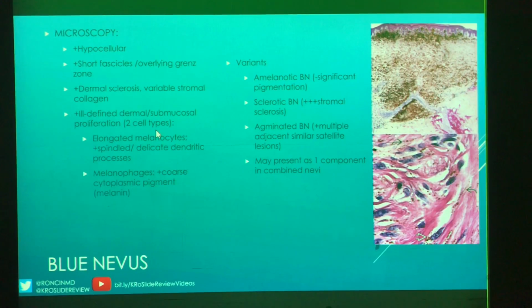There's lots of variants, as with everything. And you can see combinations of all these things. Ours was just the run-of-the-mill blue nevus.